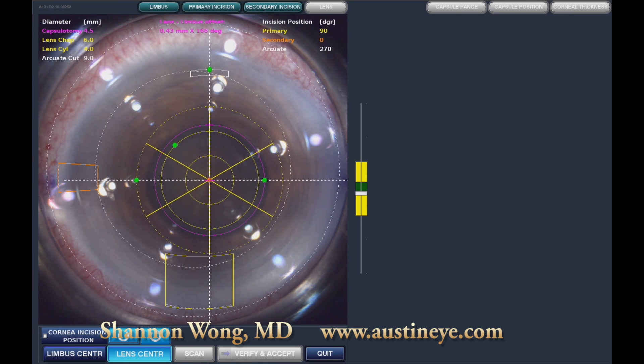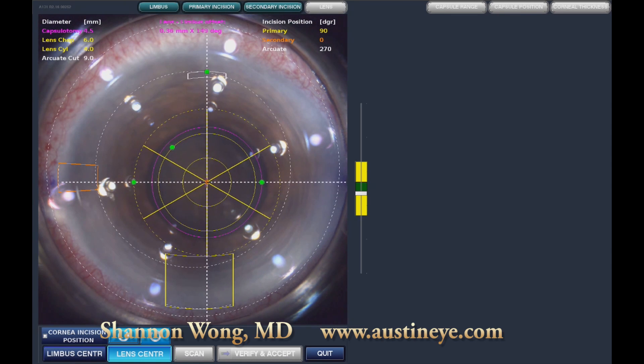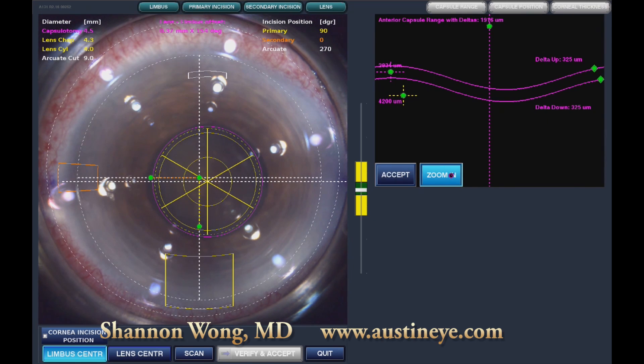Here we proceed directly to the LensX laser, and we are designing a 4.5 millimeter capsulotomy and a 6 millimeter chop pattern. This patient's pupil did not dilate very well, so we had to adjust on the fly the lens chop diameter. We reduced it to about 4.3 millimeters, dividing the lens into 6 pieces.